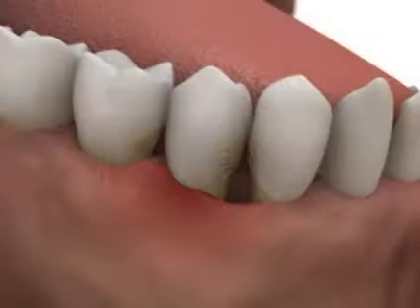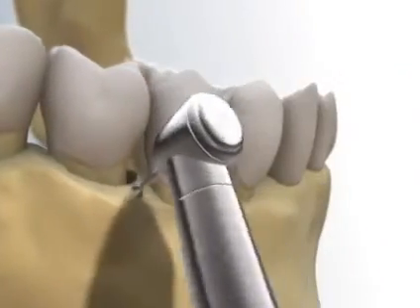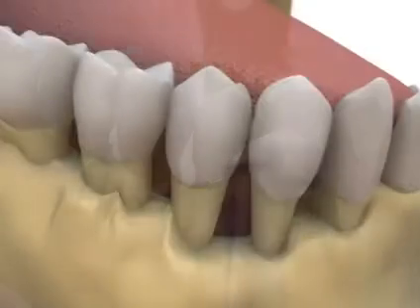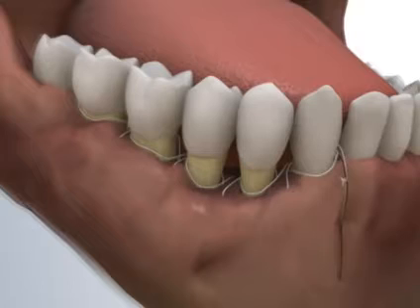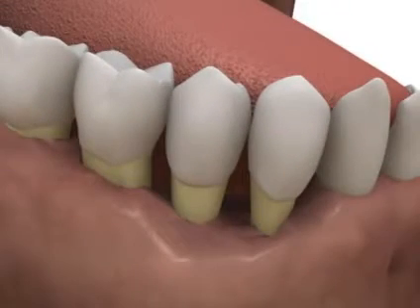The continuing presence of periodontal pockets with inflammation will lead to future attachment loss. Osseous resective surgery will eliminate the inflammation through a series of carefully orchestrated steps for recontouring of the alveolar bone and management of the overlying soft tissues. By reshaping the alveolar bone, the gingival morphology is re-established and periodontal pockets are eliminated, providing a normal positive osseous architecture. This allows the patient to maintain periodontal health in the long term.